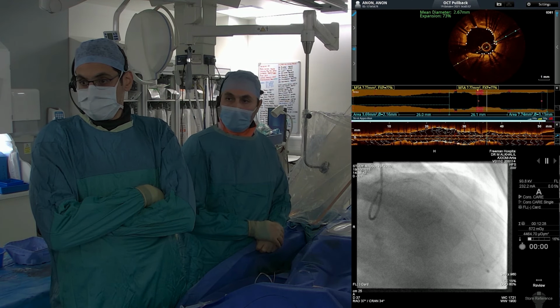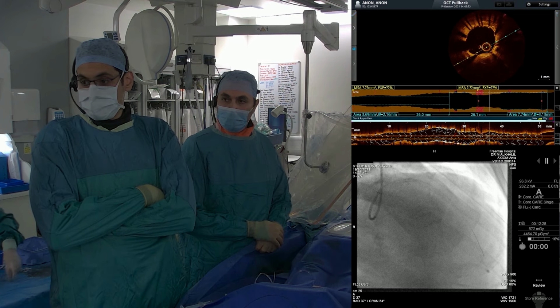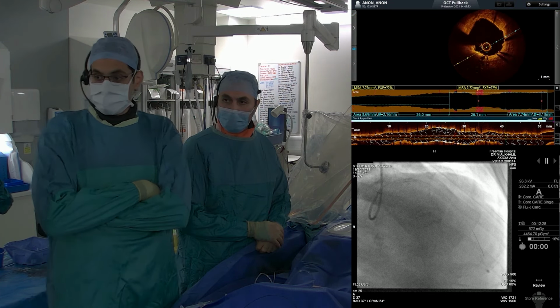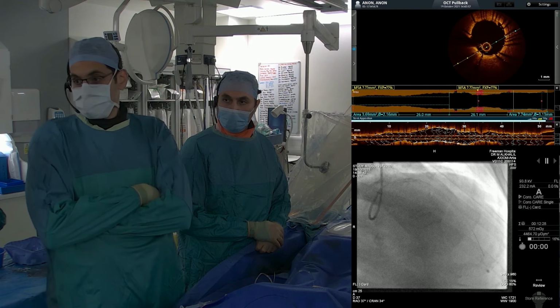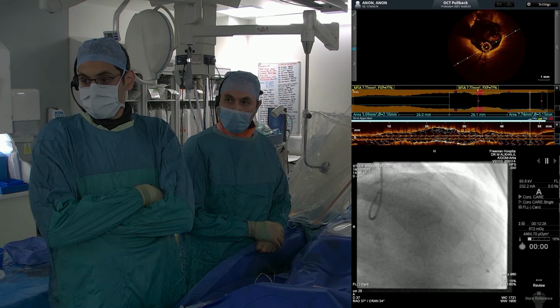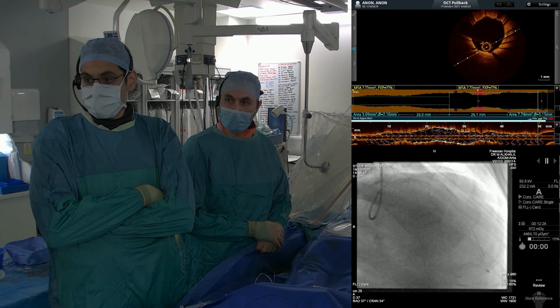If you just keep going, Dave, yeah. The stent in stent, I think he needs a little bit of exactly. Yeah. Take a forward 12. Yeah. 1, 2, 3, 4. It's probably a 4.0 vessel at that point. Oh, and we could do some measurements actually. Keep going, yeah. And here is you landing beautifully.